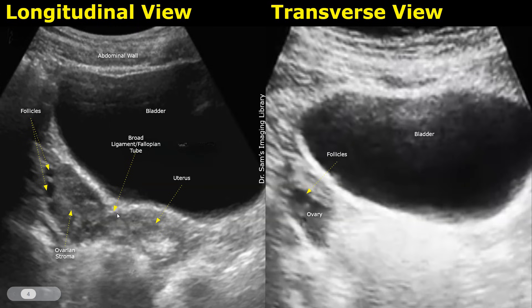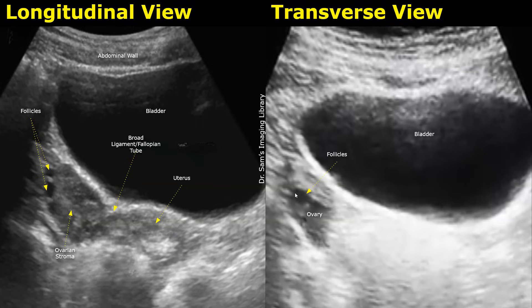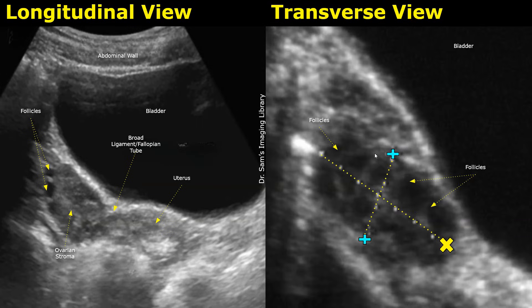On the right is a transverse image showing the distended bladder and the right ovary. You can see an oval-shaped structure with two distinct anechoic follicles. Because of these follicles, we can distinguish the ovary from nearby tissues. This close-up image of the ovary in the transverse plane shows the ovary appearing more hypoechoic due to the presence of follicles.